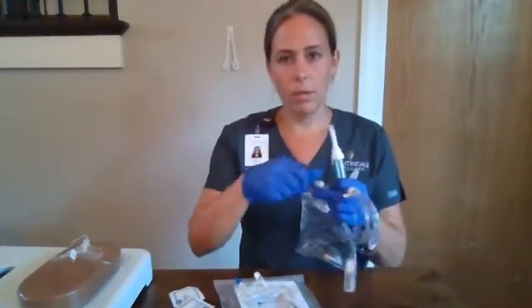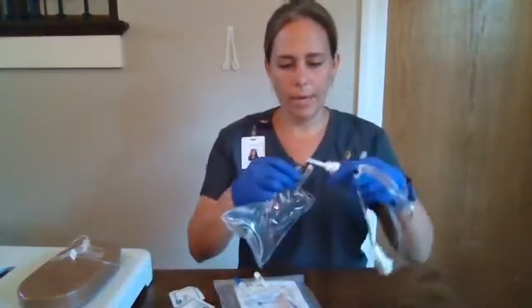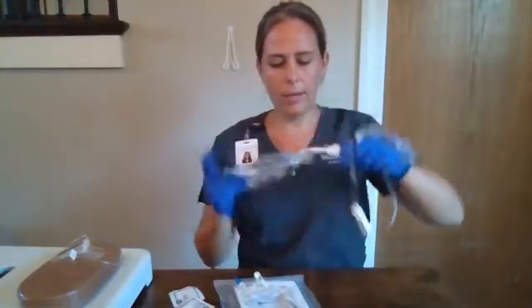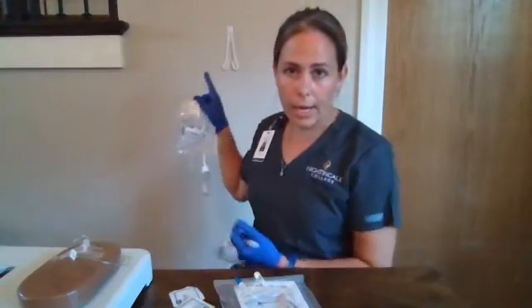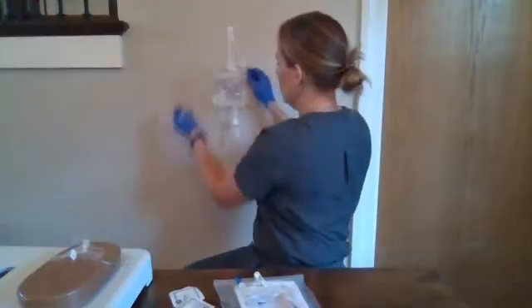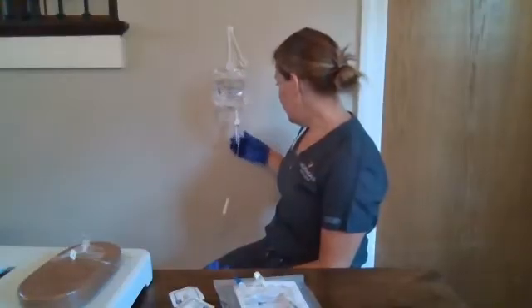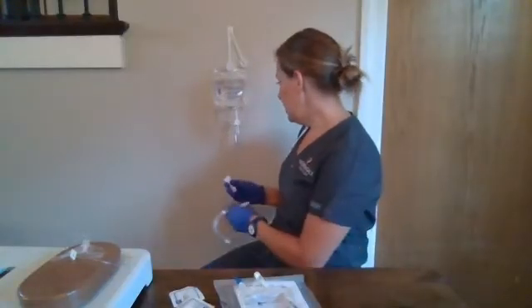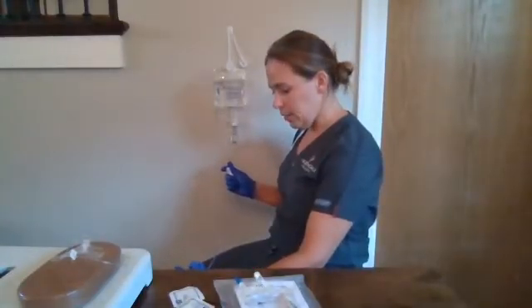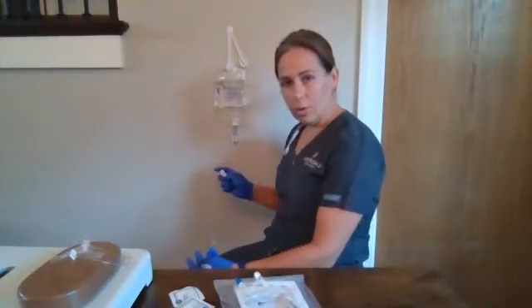So we will pull the top off of our fluid and the top off of our spike, and then spike the bag. Since I know I'm going to be doing a piggyback, I have hung up the hanger and we are going to put it on the lower hook. We're going to squeeze our drip chamber until it is half full with fluid, and then we will slowly open up our roller clamp until the fluid has filled our tubing and there are no air bubbles present, then close it.